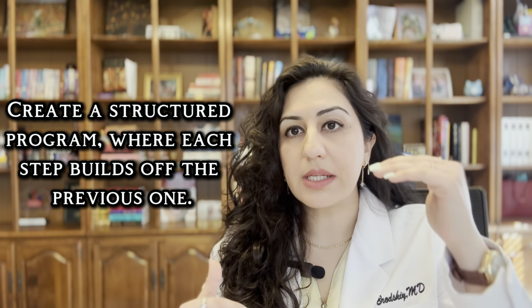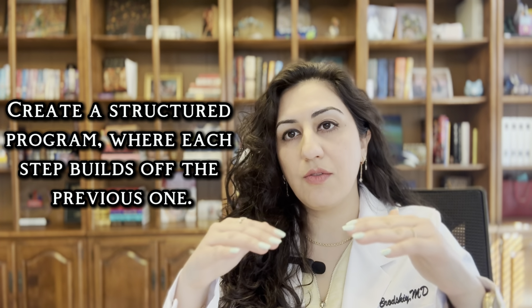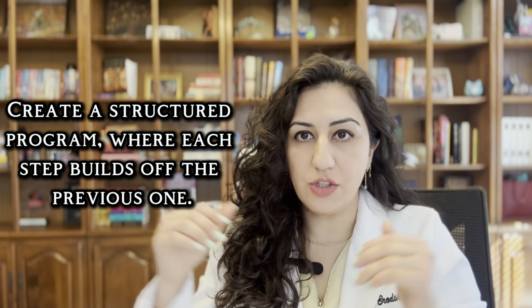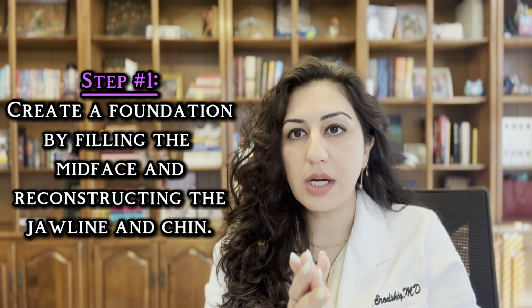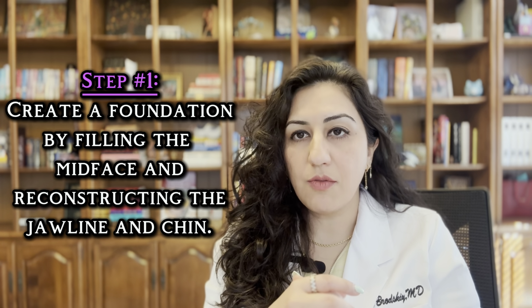But if they are a candidate for filler, you want to be able to structure their program so that you're building on what you do. You want to create a foundation of dermal filler so that you use less with each step. So let's go through it. The first thing you want to do as you assess your patient is make sure that you rebuild the foundational aspects of what they're missing.